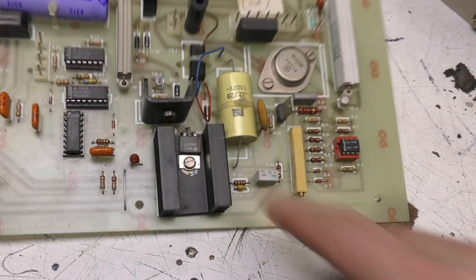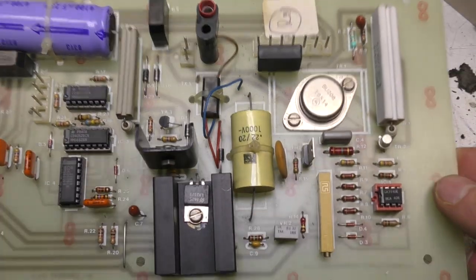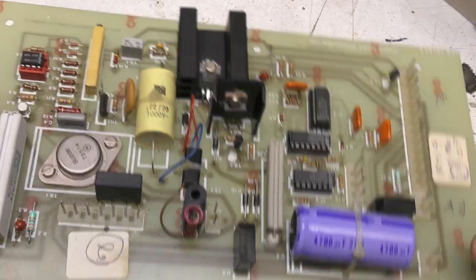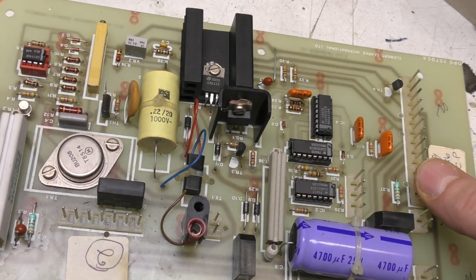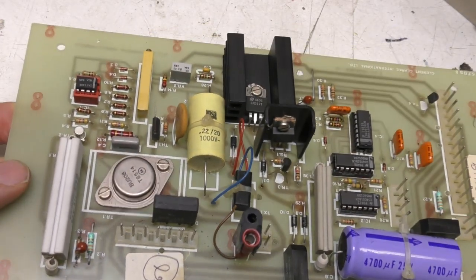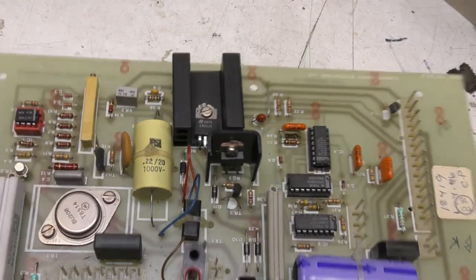One thing is quite notable, there's quite a few RS own brand parts on here. So that cap, resistor, there's quite a few other bits on this, and also in other parts of it, like the rectifiers. And of course this thing would have been built in pretty small quantities, and back in the 80s it wasn't as easy as it is now to get parts in small volume. So using a supplier like RS, although they'd generally be fairly expensive, the convenience factor of being able to get a lot of parts from the same supplier probably overrode that. And that was very typical back in those times. There were loads and loads of companies just making niche low volume specialist things, and they were all fairly big customers of RS.